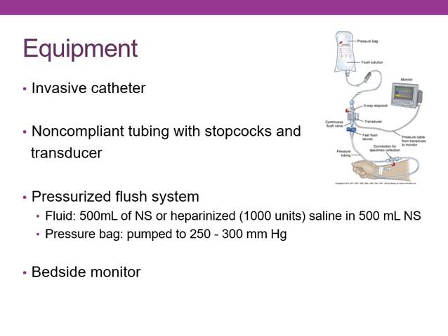It's important to know what we have going, and it's important to think about, do I want to use heparin? Would that be contraindicated? This isn't a lot of heparin, but it is enough that could cause a problem, especially if somebody has thrombocytopenia, or this is enough heparin to put them in heparin-induced thrombocytopenia. Now, this is not an infusion like on a pump. The fluid does drip into the patient. When I clear my line, I'm giving them the fluid, so I will lose fluid in it, but it's not a drip.